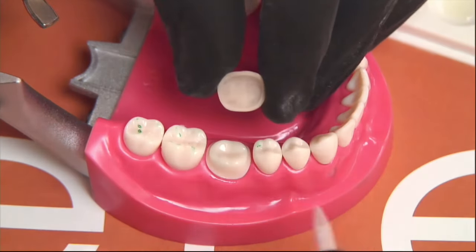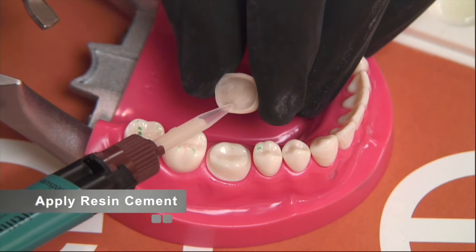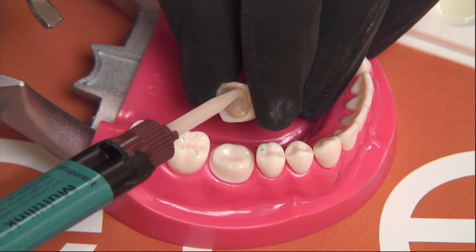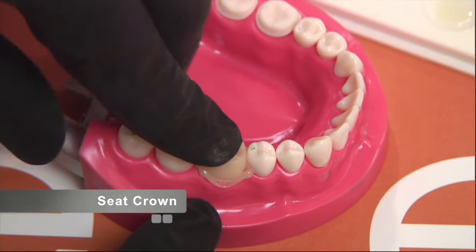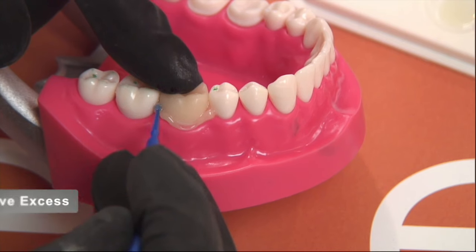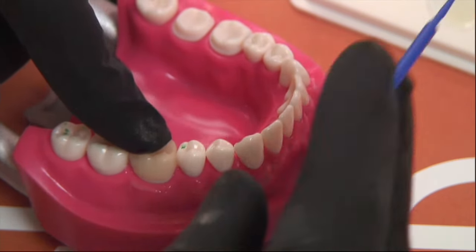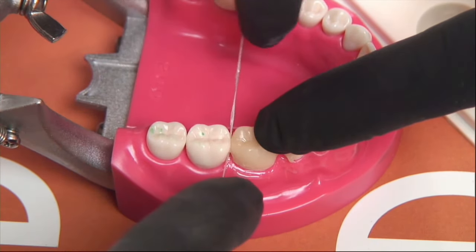If you don't aggressively scrub the bonding agent into the tooth structure for 30 seconds, you increase the chance of sensitivity because you're not bonding well to the surface. Once you've aggressively applied it for 30 seconds, air thin the adhesive — make sure there's no pooling of the bonding agent anywhere. Then load the crown: line the internal rather than overfilling it, to ensure adequate coverage with no voids or porosities. Get the cement close to the margins so you see excess coming out, confirming no voids. You can tack cure to reach a gel stage if you choose.